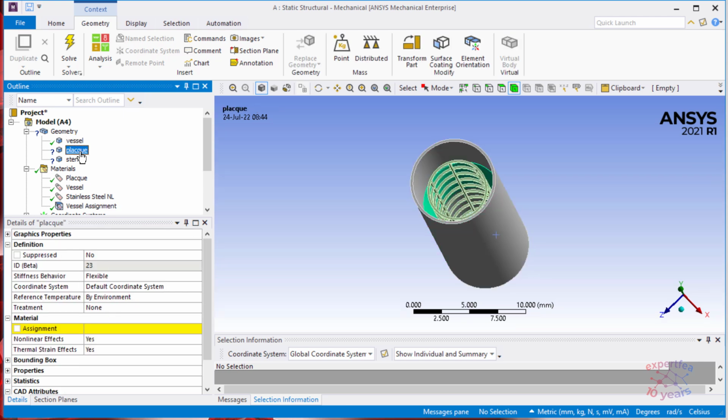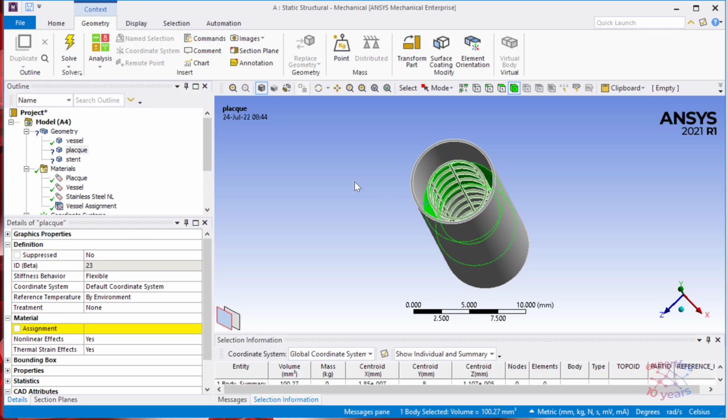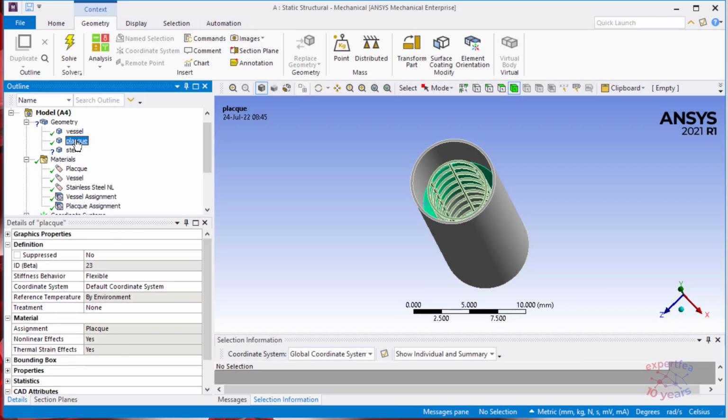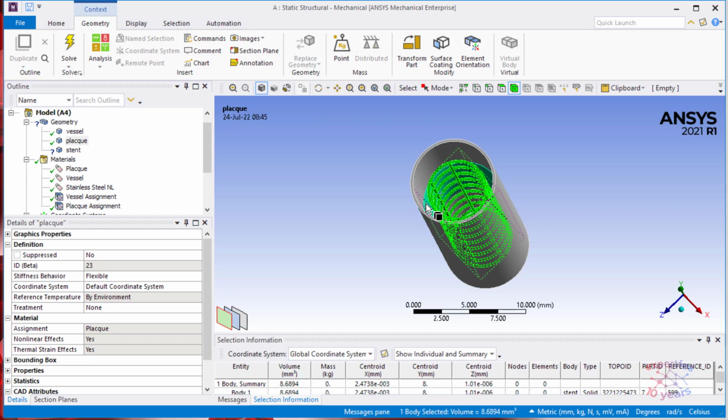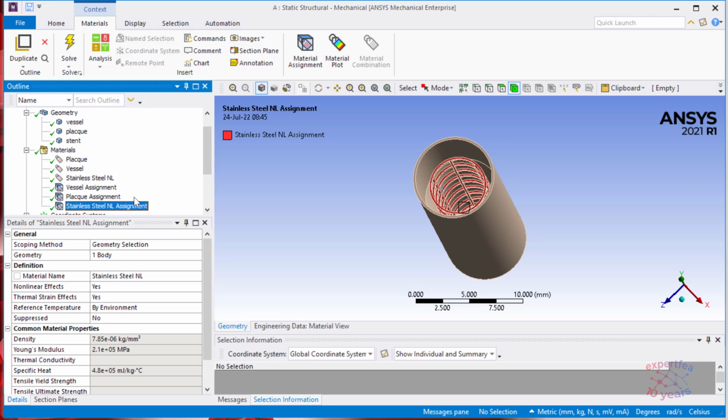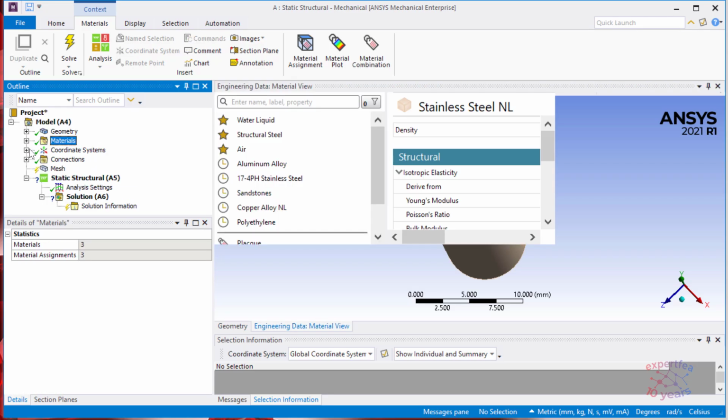So let's repeat. Plaque, click plaque, right click here on the plaque material, create material assignment, and you can see that the plaque is assigned. So click the stent, right click here, stainless steel, nonlinear, create material assignment. Alright, we have the materials defined.